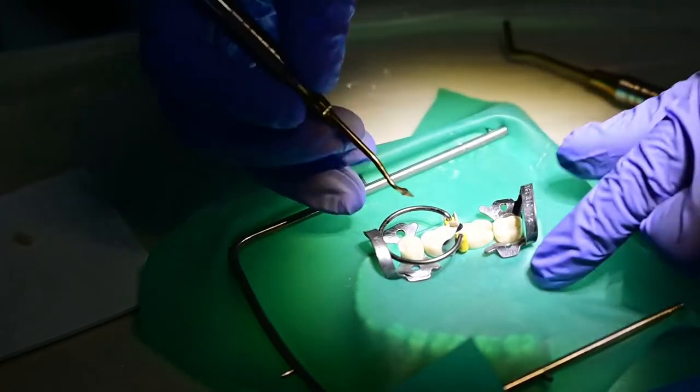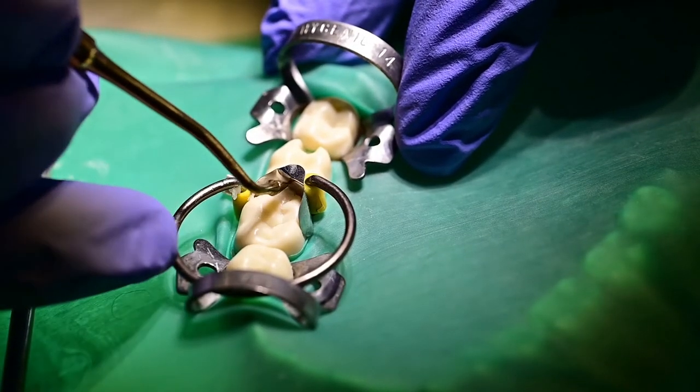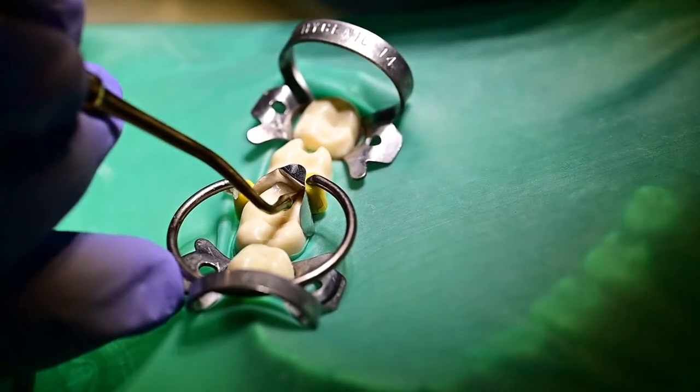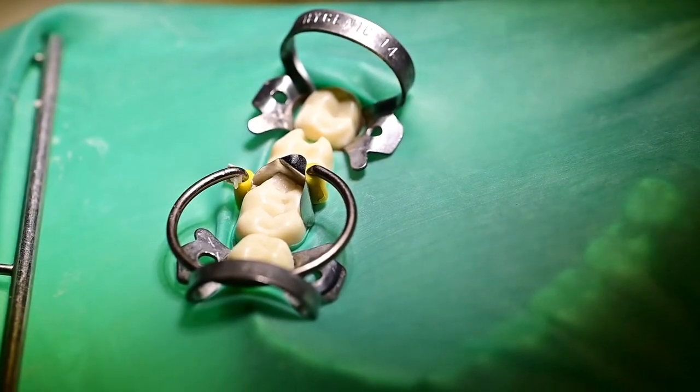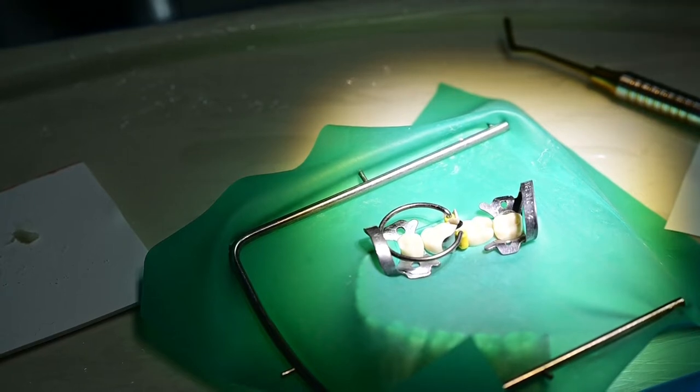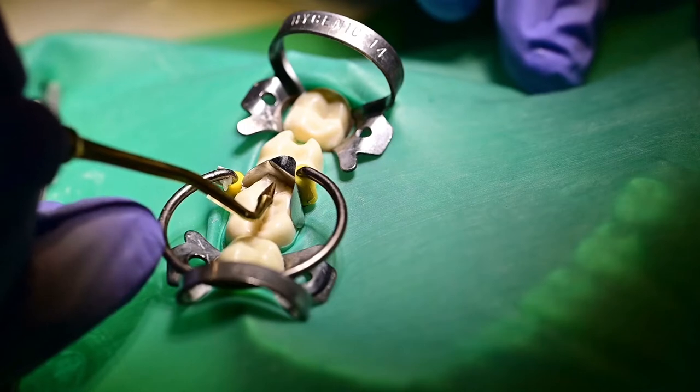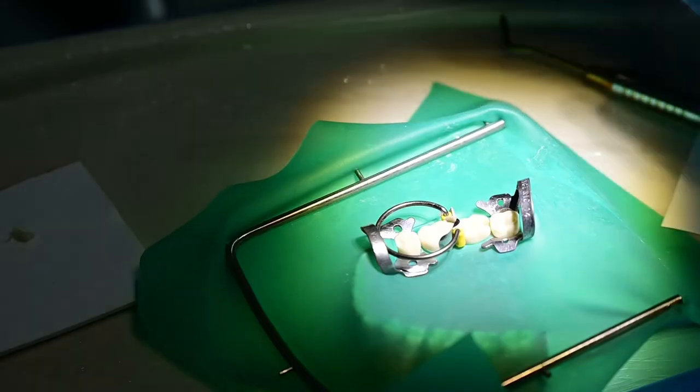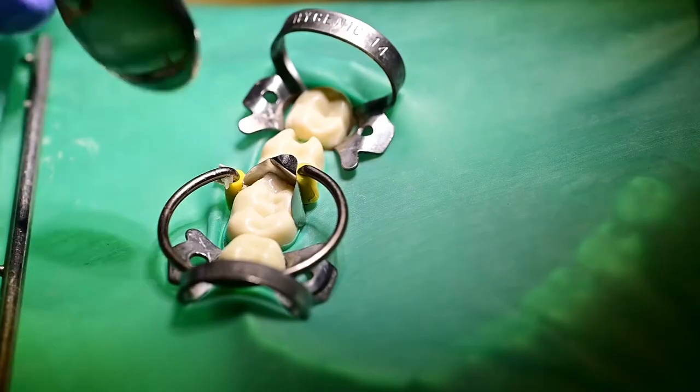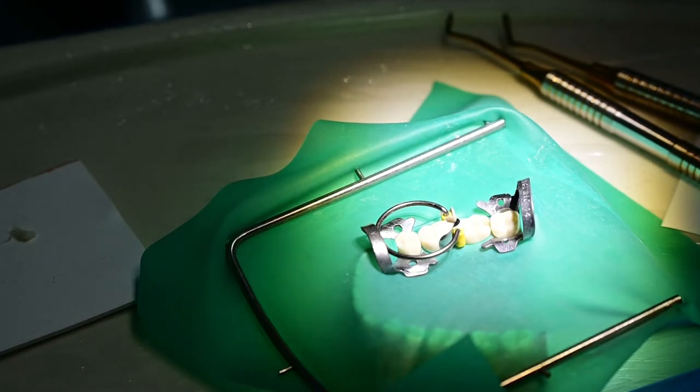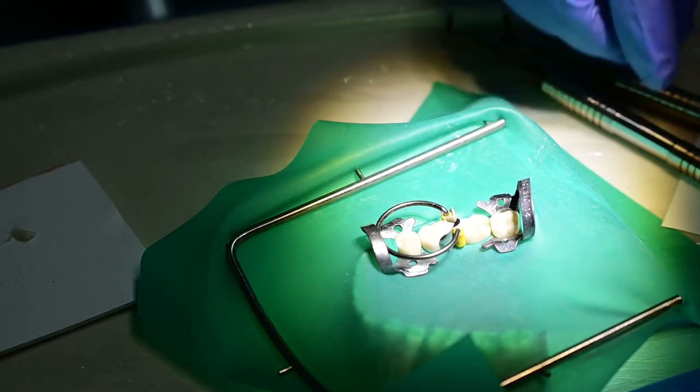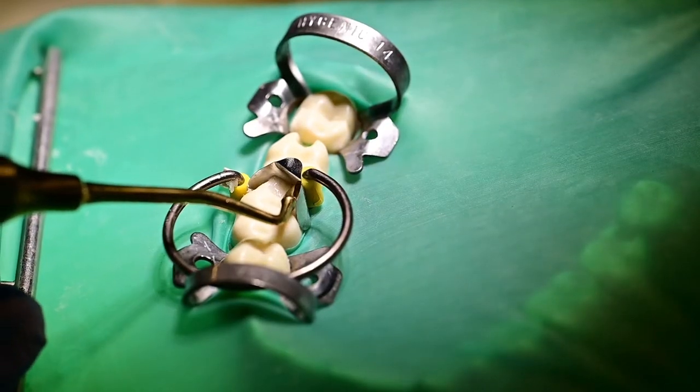And so I am about to be done with the packing process. The beauty with the alkasites is that they are biosmart, they are biomimetic materials. After the material is set, we will polish it the same way.